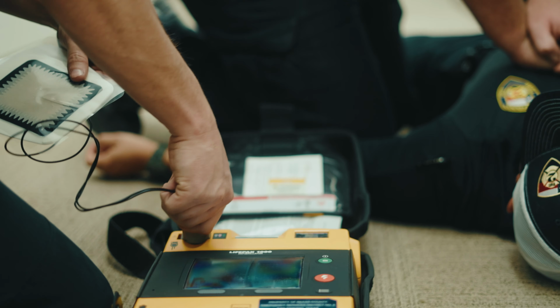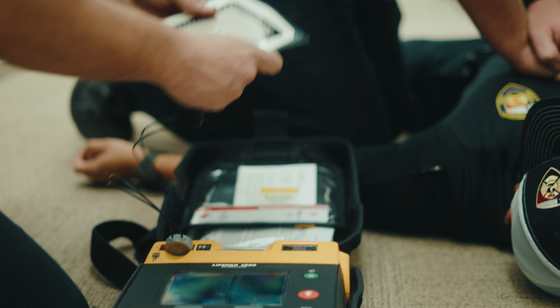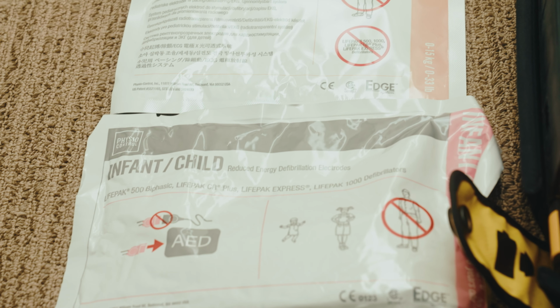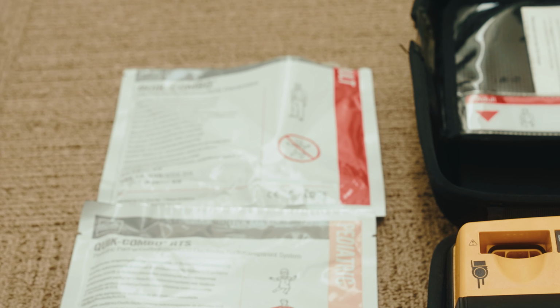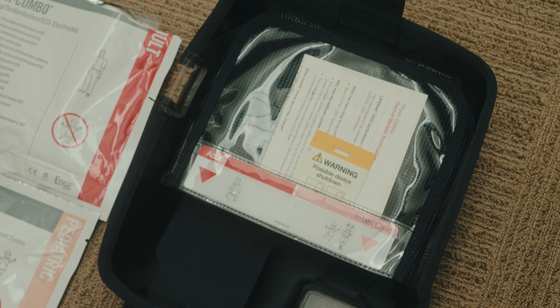If the victim is wet, such as if they were in a tub or a pool, quickly dry the chest with a towel or clothing prior to applying the pads. The victim does not have to be completely dry, only the chest. Once the pads are applied, you may have to plug in the connector to the AED. Please note, there may be 2 different types of pad connectors in your AED, one designated for children and one for adults, which will be notated on the packaging.